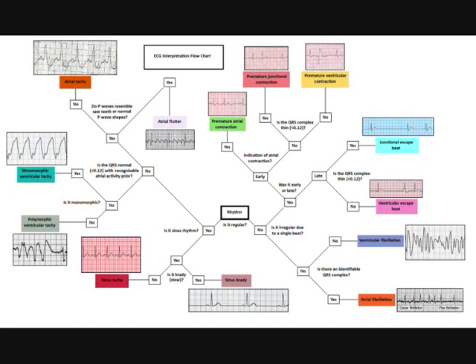If you're on the other side to see if it is a regular rhythm, the first thing is: is it sinus — is it your typical sinus rhythm that we're seeing? If yes, we can move into a question that helps differentiate between two main kinds of sinus rhythms. Is it brady — is it slow? What is the rate? If the rate is bradycardic, then logically we have sinus bradycardia, with a nice picture explaining just how slow it is. But if it's not brady, then it very well may likely be sinus tachycardia.